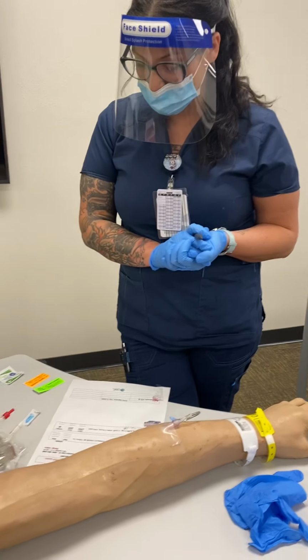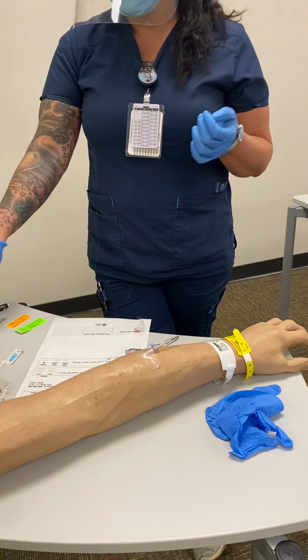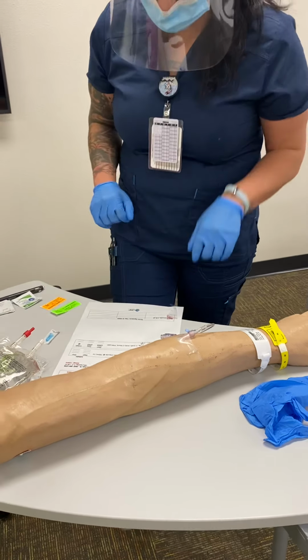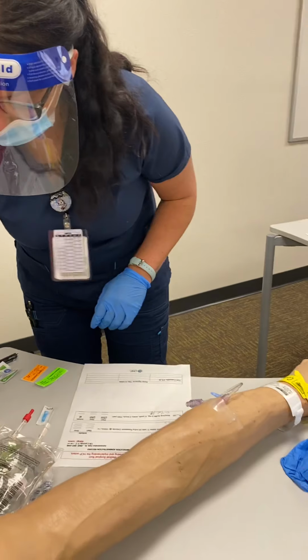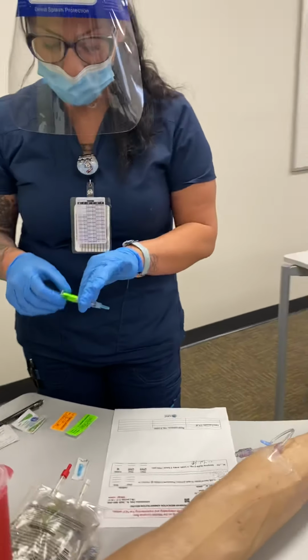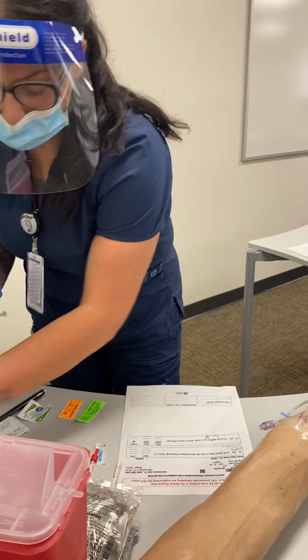And then since we are doing IV medication, IV insertion at the same site with these meds, I need to make sure that they are compatible, and they are. So we are going to go ahead and give this patient her morphine. So I'm going to do my third med check. I have applied gloves, I've washed my hands, I've done all that good stuff. So, okay, got my meds. I'm going to go ahead and flush.